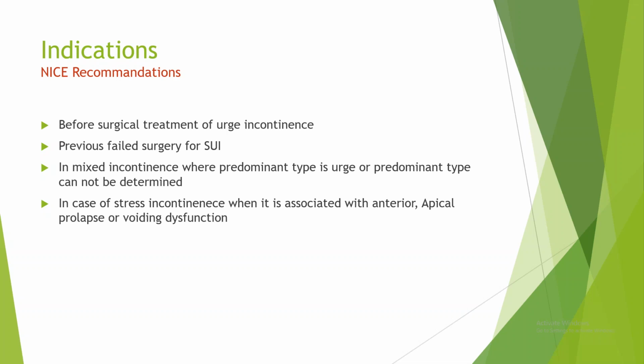For pure stress incontinence, there is no need to do urodynamics, even before surgical treatment. Only if it is complicated by prolapse or voiding dysfunction do you have to do urodynamic testing. And in mixed incontinence, where urge incontinence predominates, or when we are unclear which type is predominant.